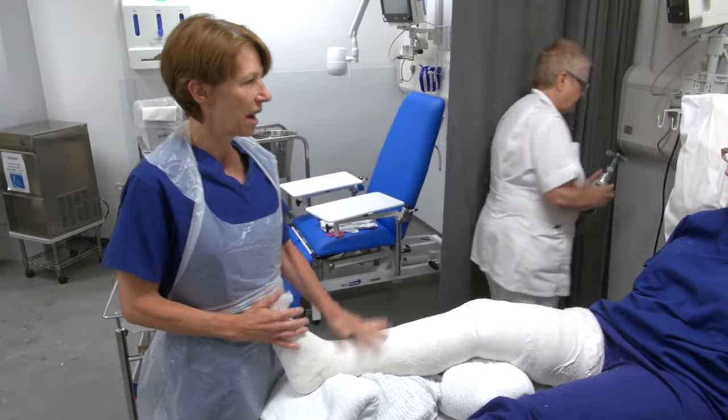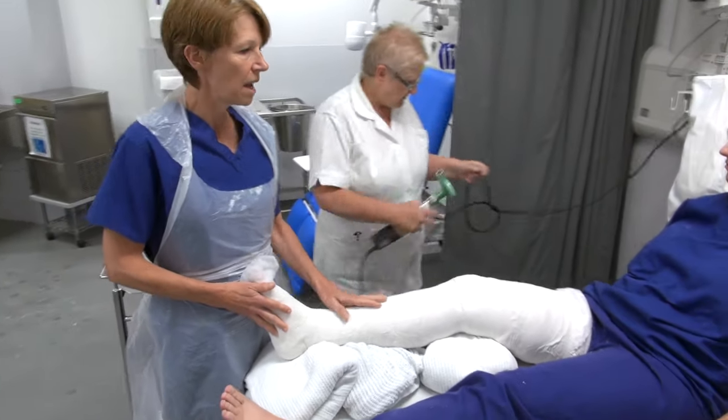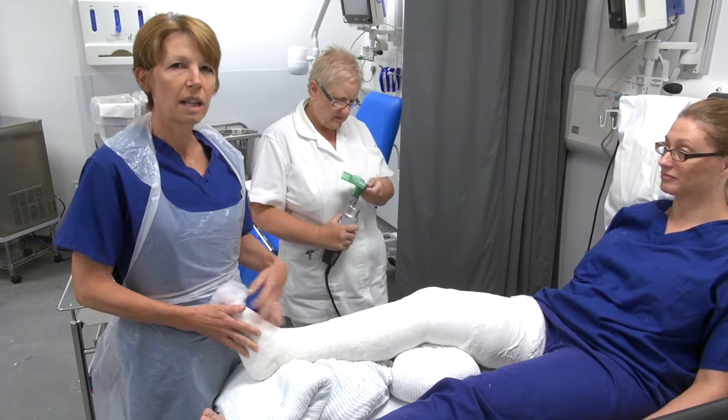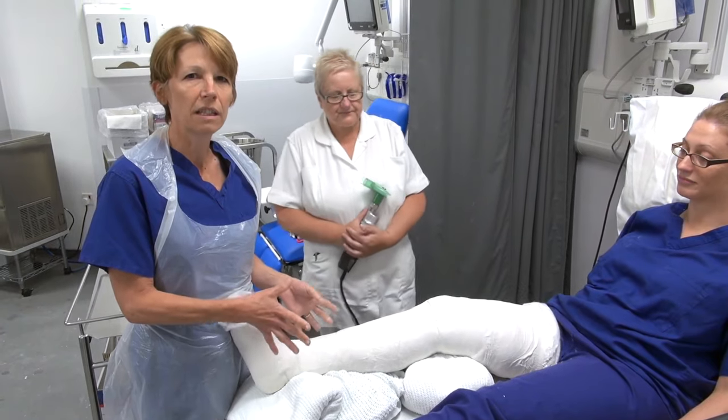So we're back again after a little break — this plaster has now been on for about an hour and had a chance to harden off. The aim now is to split it before the patient goes to the ward. This will allow, if any swelling takes place, that the circulation will not be restricted at all.